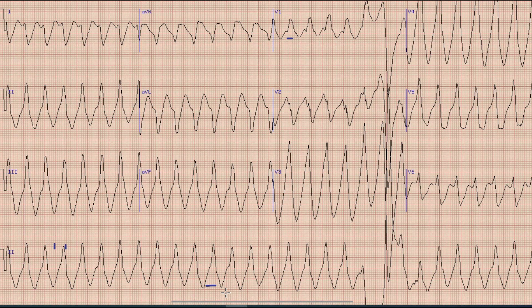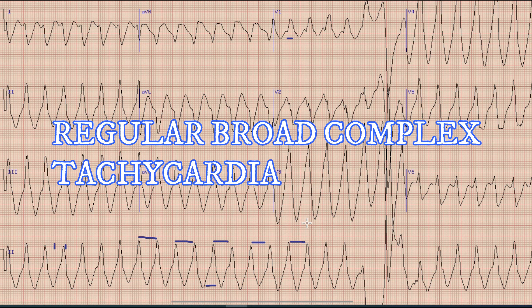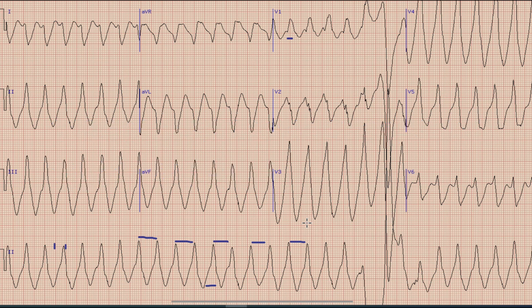Whenever you find an ECG with broad complex tachycardia, the next thing you should ask yourself is whether this is a regular or irregular broad complex tachycardia, because both have different differential diagnoses as well as different management strategies. In the next step, we look at whether the RR intervals are regular or not. Here you can see in the rhythm strip that the distance between two R waves — the RR interval — is almost identical; there is no variation in RR interval.